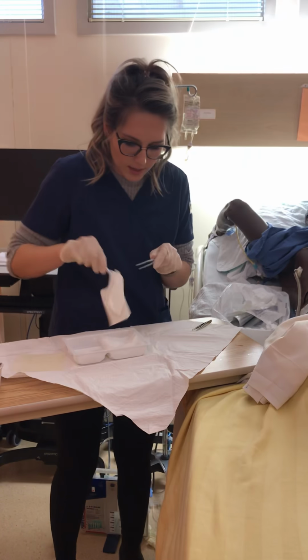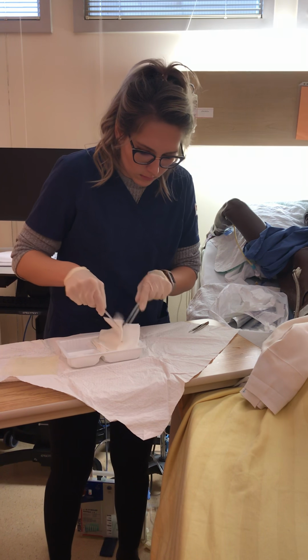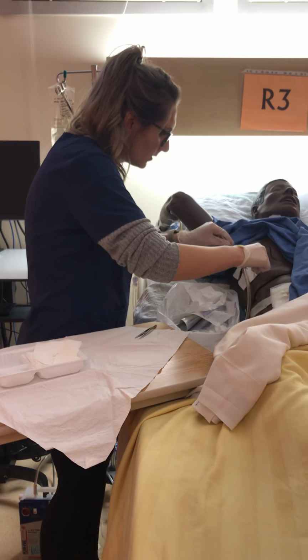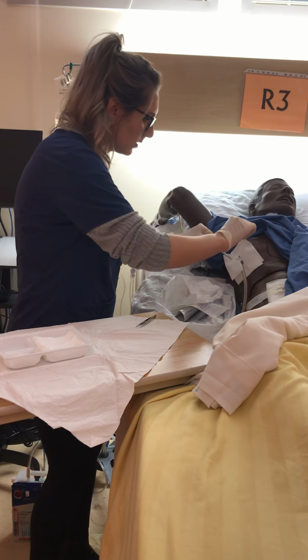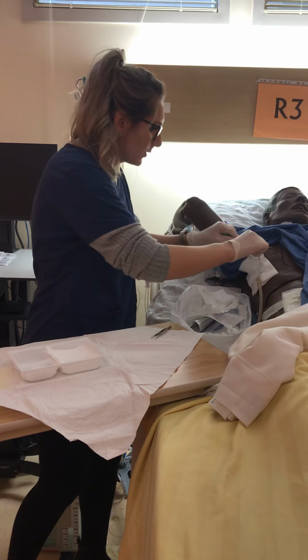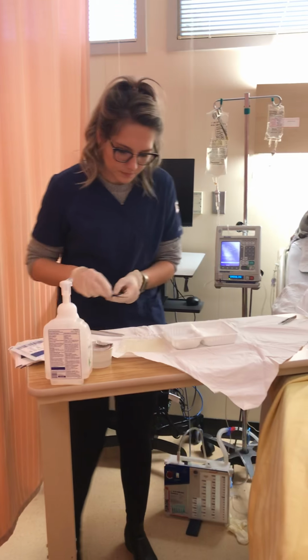Now I'm just going to grab my drainage sponges. Okay, so I've got this. I'm going to twist it up so it can fit around the center part, keeping this sterile. That's what's important here. Okay, I don't want it to touch the wound. Now I'll just take my 4x4 gauze and put that over the top, and place this around the dressing for the insertion site.